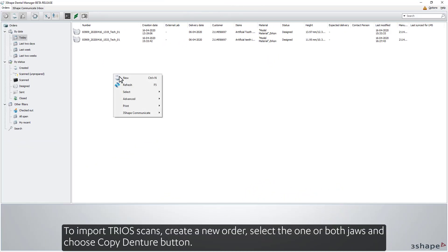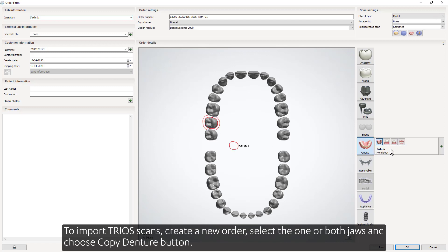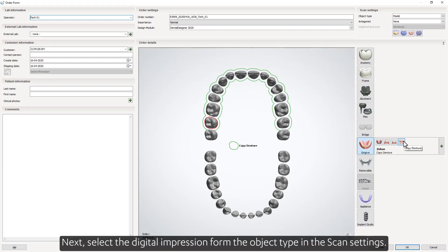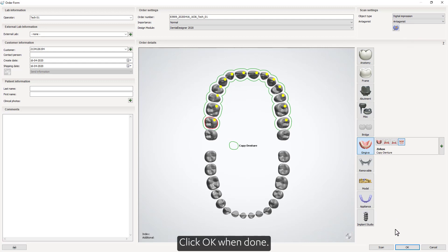To import Trios scans, create a new order. Select one or both jaws and choose the Copy Denture button. Next, select the Digital Impression from the Object Type in Scan Settings. Choose Antagonist if needed. Click OK when done.